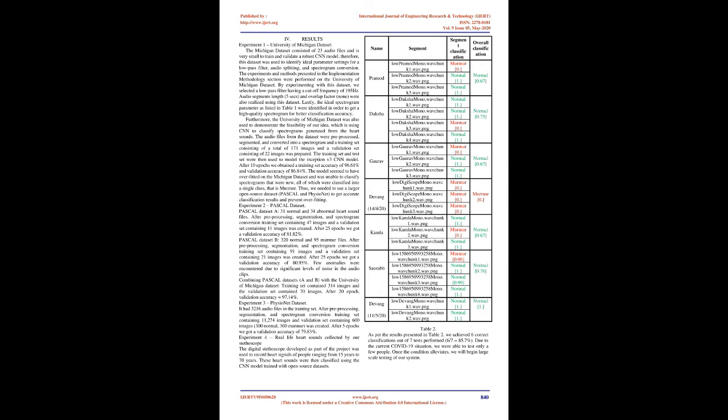For our system, we are going to use all the layers of the Inception v3 model except for the last fully connected layer, as it is aimed at the ImageNet competition, and all the previous layers are made non-trainable. Retraining of some of the lower layers is avoided to prevent overfitting. We used binary cross entropy as the loss function and RMSprop as our optimizer with a learning rate of 0.0001. Due to improved performance, we used models trained using the second method, i.e. transfer learning, for our final system.